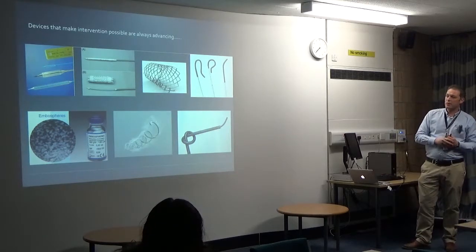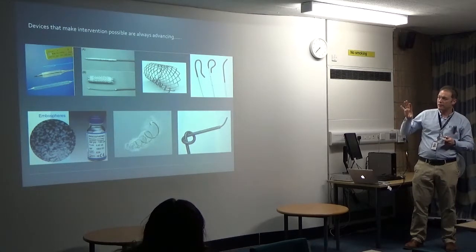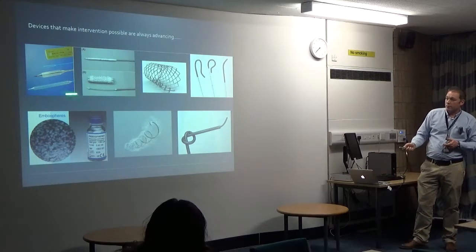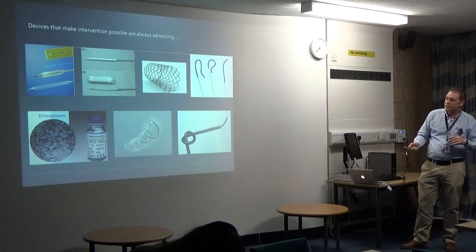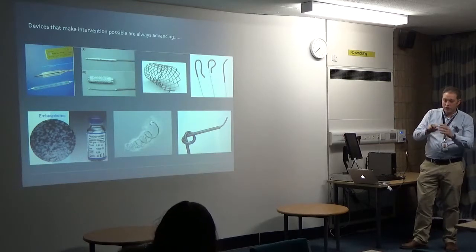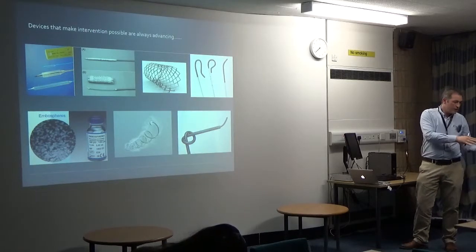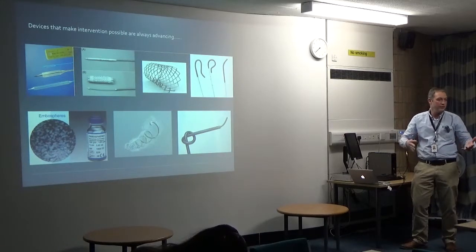In the same way that lots of technology companies develop computers and scanners and all the rest of it, we have fantastic medical device companies that develop all the different bits of kit that make our job possible. So we have balloons that we can use to widen narrowed arteries or what have you. And even these are advancing in that you can get little razor blades on the inside of them to open up very tight narrowings. Or drug coating on them to stop the narrowings recurring. 5 years ago, you have one thing, and then it moves on, and then they come up with a new thing that adds some value to the treatments.